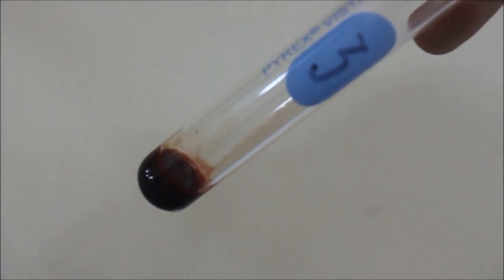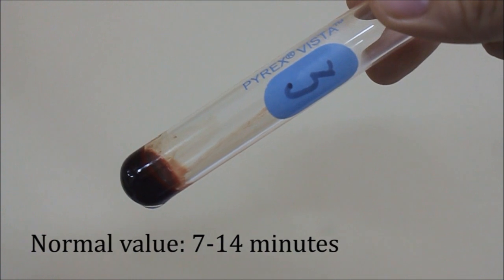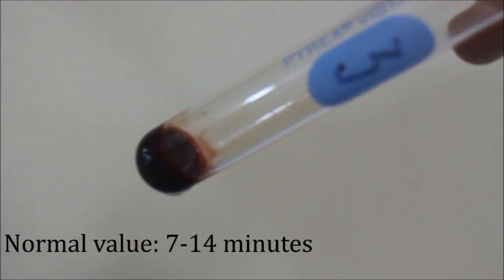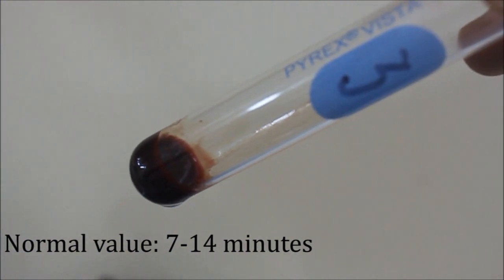The coagulation time of test tube number 3 is the reported result. The normal value for the Lee and White method is 7 to 14 minutes.